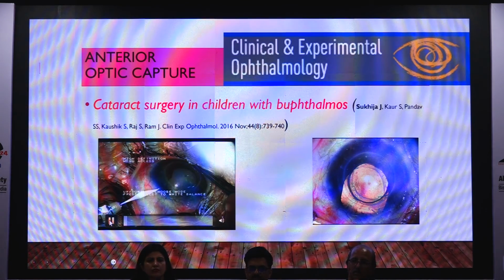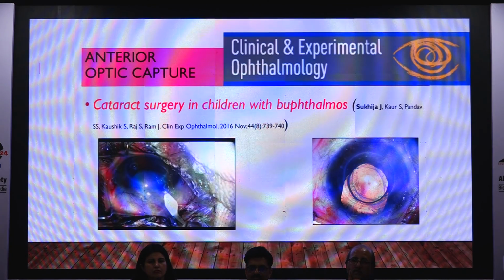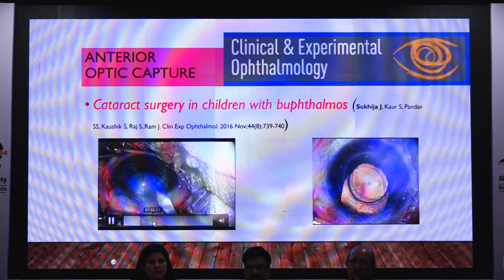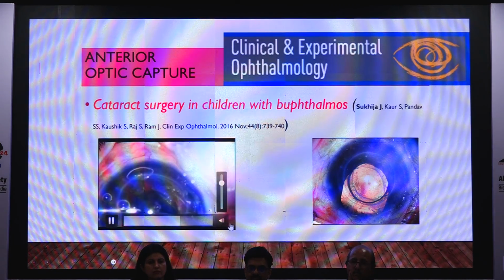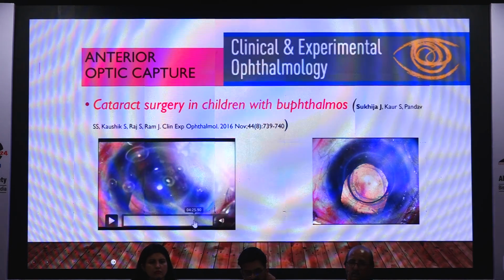So what happens here is, again, the normal routine steps are done. You stain the anterior capsule. Be careful. Try to do a corneal incision, because obviously you have a bleb there, and that could lead to failure of the trabeculectomy which has been done. And then you do a routine surgery. I'll just take you through here. So here we go.